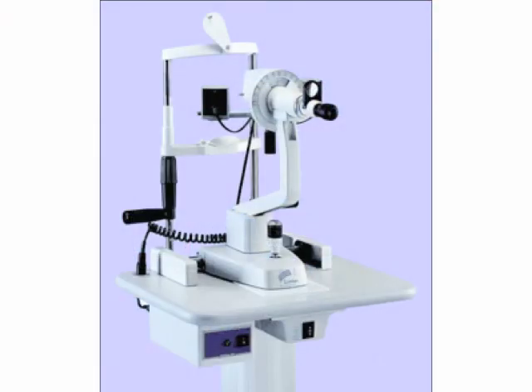This is the other sort of keratometer that we use clinically, although it's unlikely that you're going to find this in clinic. It's a Javal keratometer. It's a two-step keratometer. And what I mean by two-step is that we'll get the measurements for one meridian when we line up the keratometer properly, and then we rotate the keratometer in order to get the other set of keratometric readings.